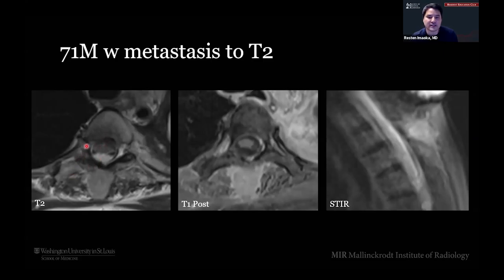And if you've ever tried to see ice inside the bone, very hard, right? Unless you're doing photon counting or something special, you're really not going to be able to see the different density changes within the bone. So this is a good example of what ice in the spine could look like.